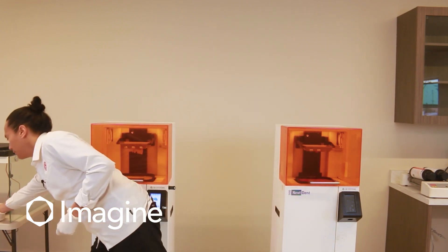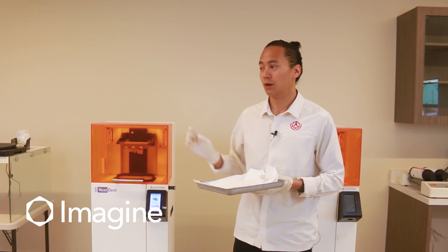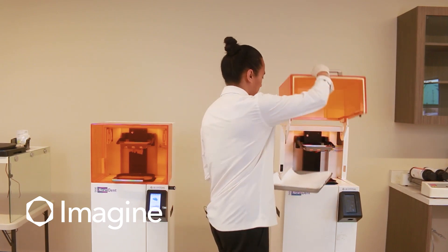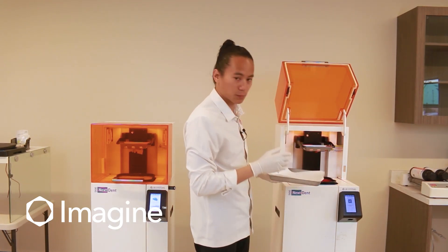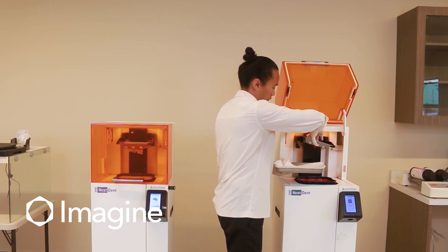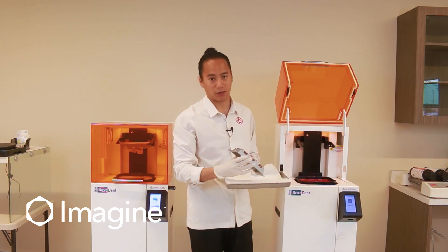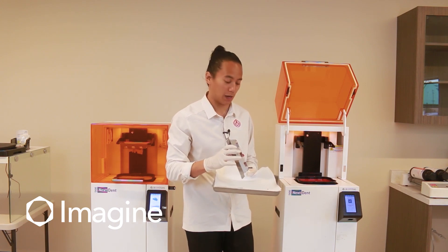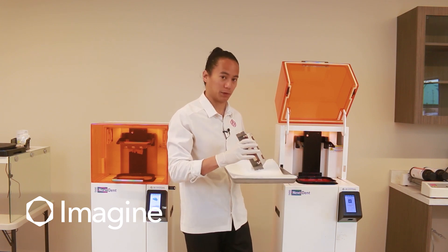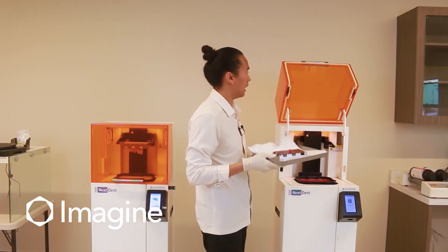I like to have a tray to catch any material that might drip when we're transferring our parts from our 3D printers to the post-processing area. We're going to open the lid and gently lift one corner of the build platform at a time. Since our units have been sitting overnight, there's not going to be too much material dripping. I'm going to place it upside down on my catch tray and then close the lid.